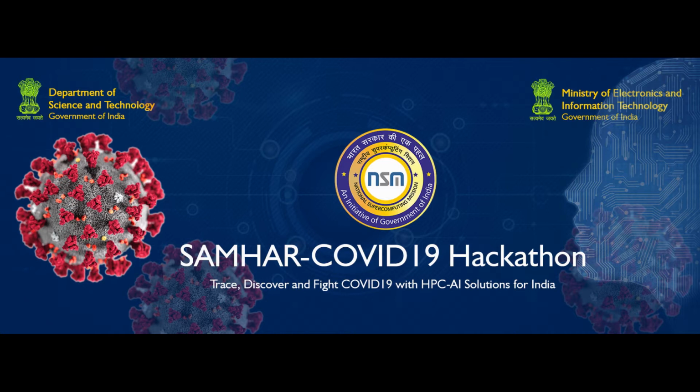We are Auggen21, our official submission video for the Samhar Covid19 Hackathon. We are trying to find the solution of the problem given in the Samhar Covid19 Hackathon, that is, diagnosing COVID-19 using AI based medical image analysis.